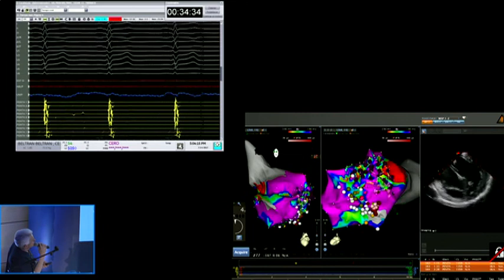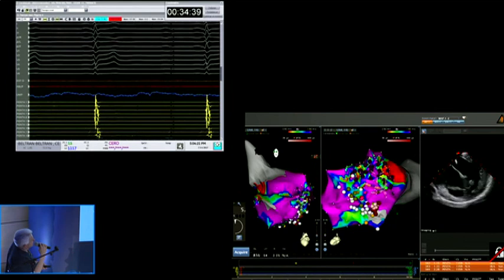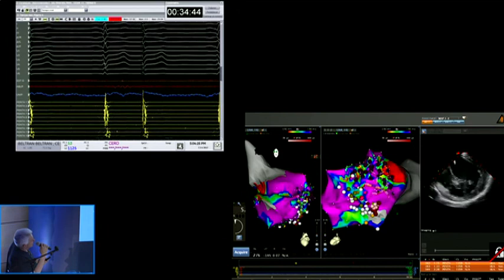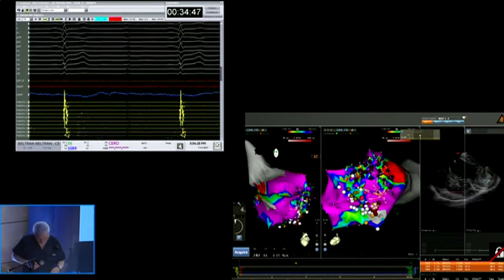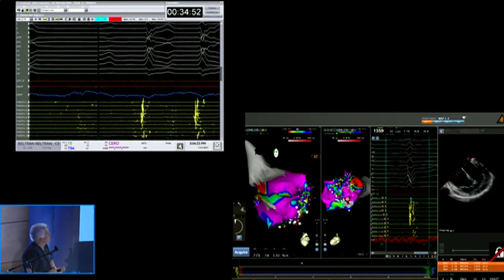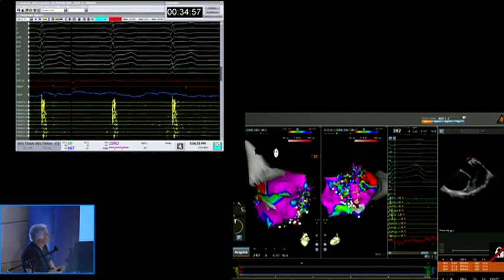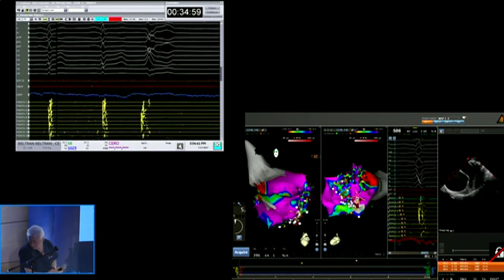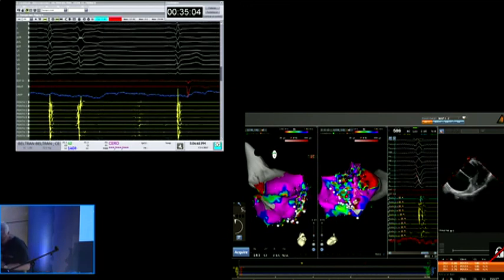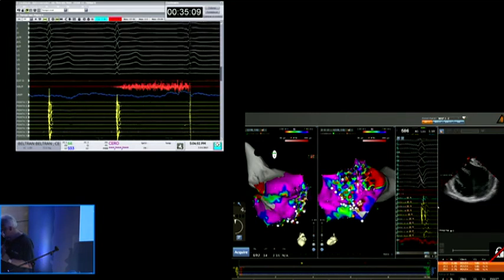That's an important point. This is the concept of the LAVA, where you have near normal amplitudes as far as the bipolar signal, yet this is clearly an abnormal propagation. It's abnormal propagation, yes. Okay. So, marca esos porque aunque no tengan voltaje de cicatriz, siguen siendo anormales. Look at that. Yep. Y aquí ya tengo que estar cerca del músculo papilar. Okay. Sí, estoy en el borde.